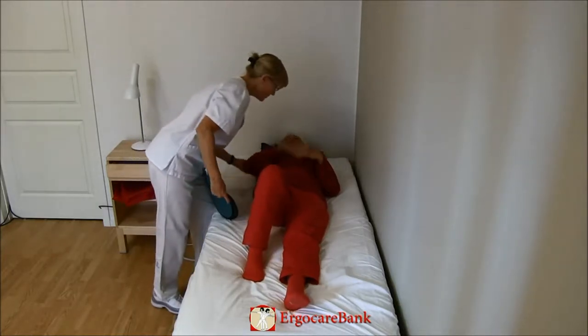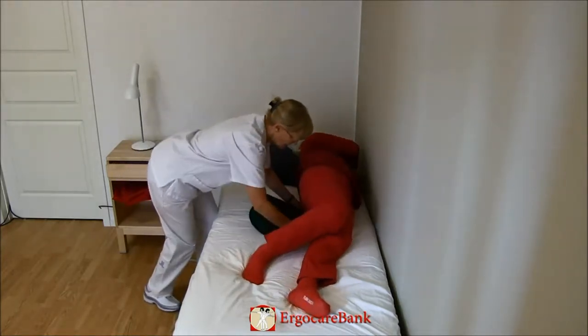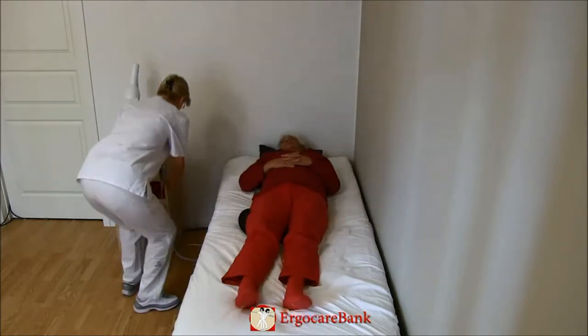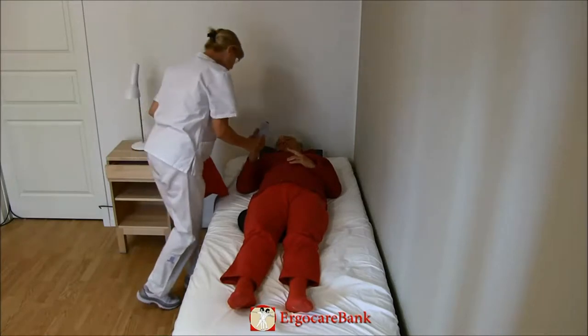The staff member instructs Celia to assist. First, bend your right knee, lift your right arm across your body, push with your right leg and roll over towards the wall, and then roll back.